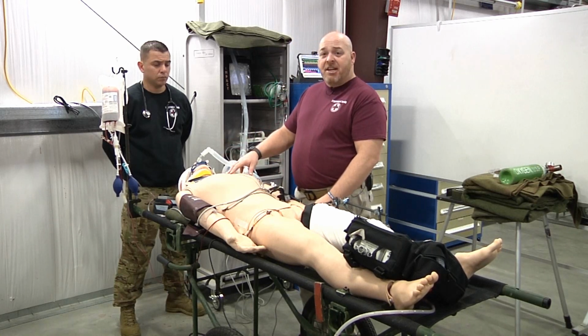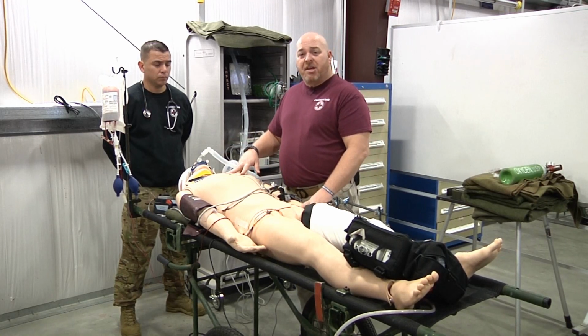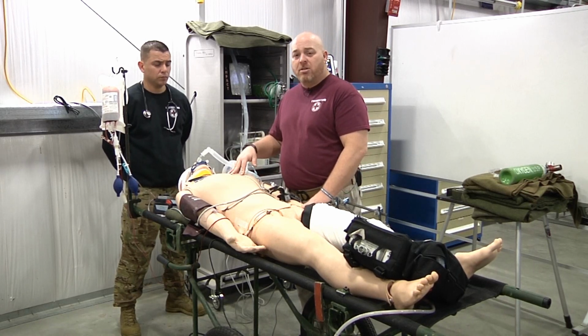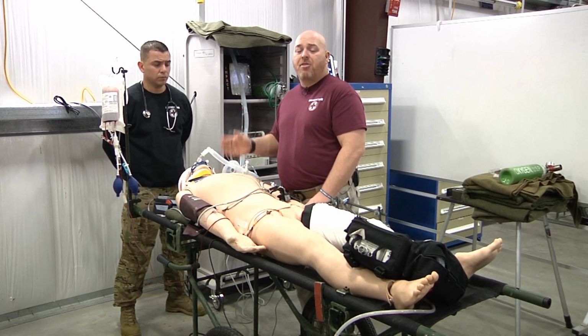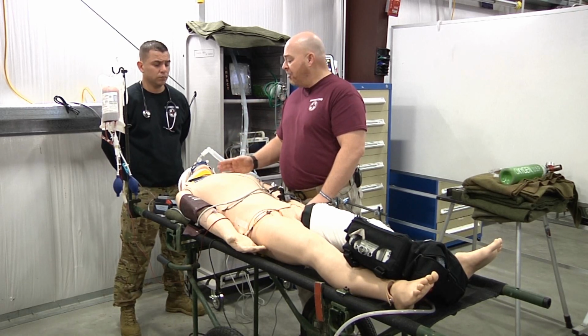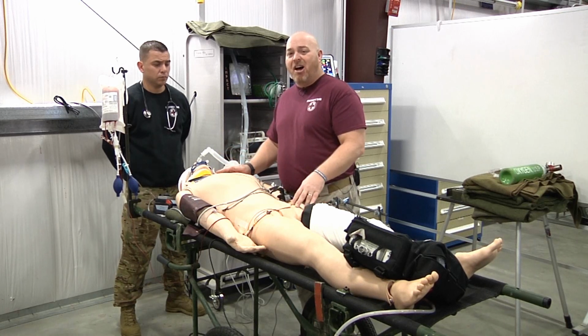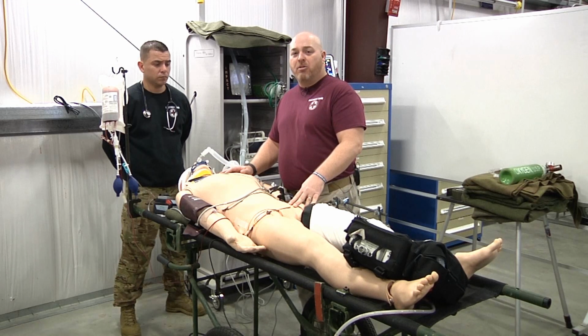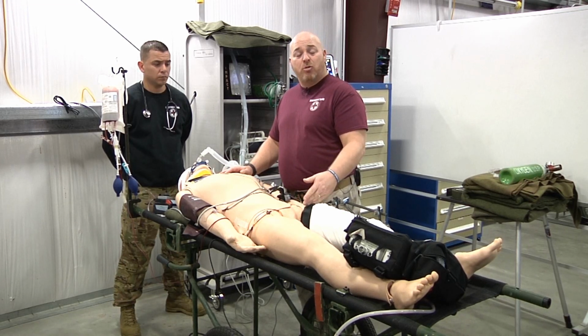As we get ready to start setting them up on the vent, some things that you want to consider. The CCAT CPG recommends that all ventilatory patients during transport will have their head of bed elevated 30 degrees. So we want to make sure that we elevate their head of bed 30 degrees for transport. And also while we're setting them up on the vent, we want to use the hospital's O2 as long as possible. We only have a limited supply of O2 bottles in our aircraft, and we're going to be here for another 10, 15, maybe 20 minutes.